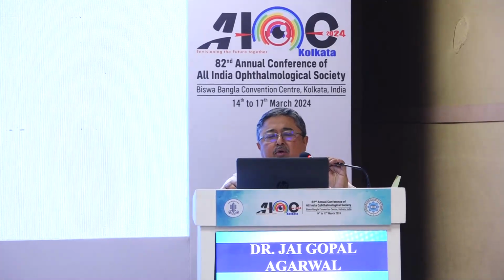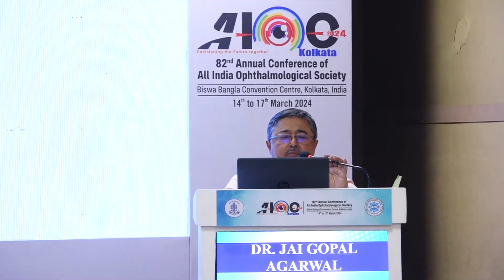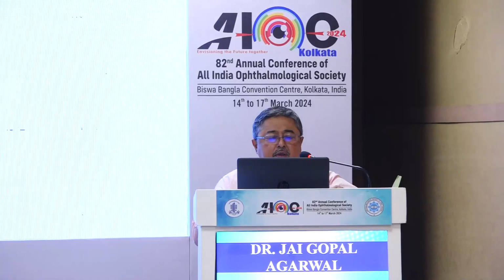Thanks, my good friend Dr. Pranav has given me the chance for this session. My topic is IOL power calculation. The major factors affecting IOL power calculation, as you all know, are the corneal curvature measurement, the central topography, axial length measurement, ACD, the personalized A constant and prediction of effective lens position, and dry eye.